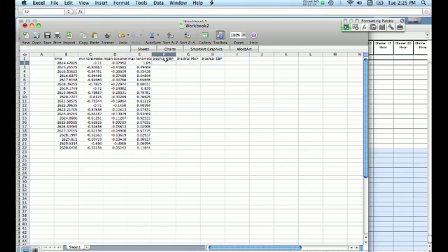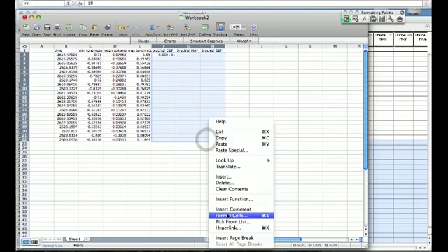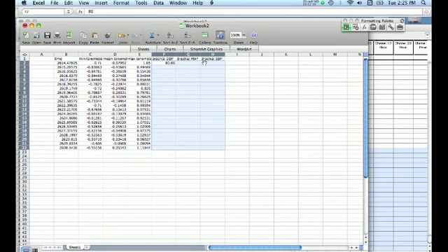This particular value you would have written down after you had done a regular brachial arm pressure, so it would probably be 80 or so. You need one of these values. Just make sure that this is in proper notation. And let's say our brachial systolic pressure was 113.